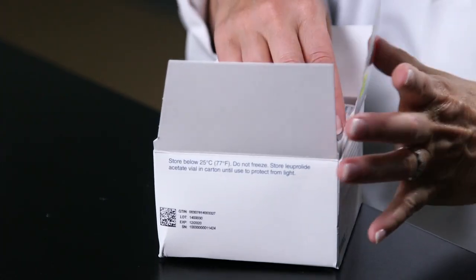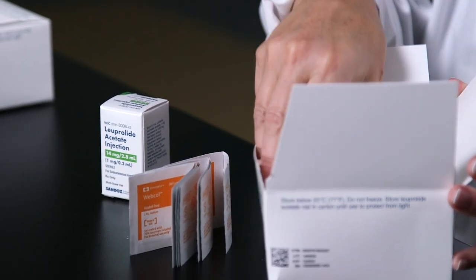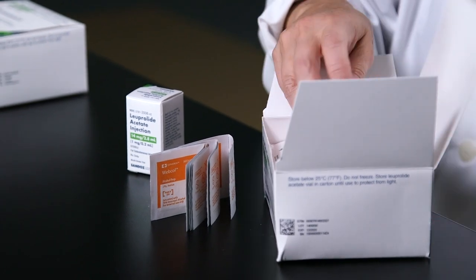Opening the box, you'll have a vial of medication. They supply alcohol wipes and orange-capped insulin syringes for administration.